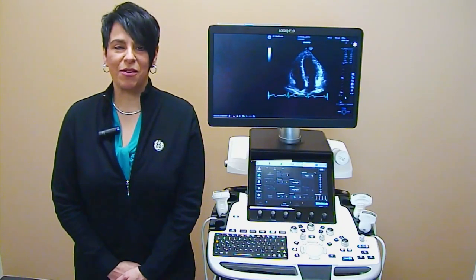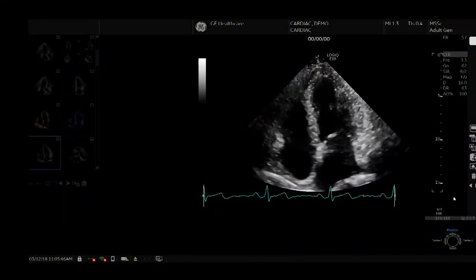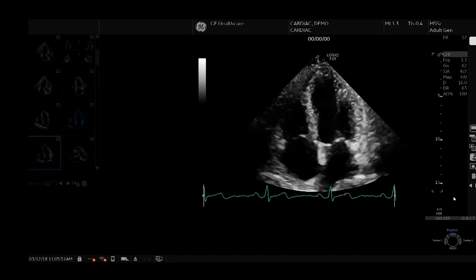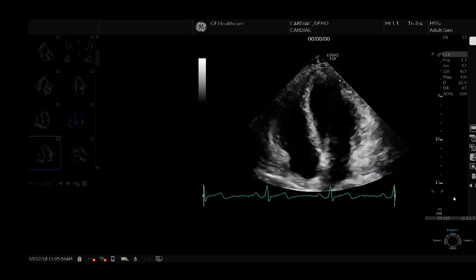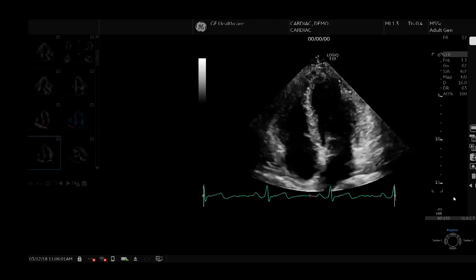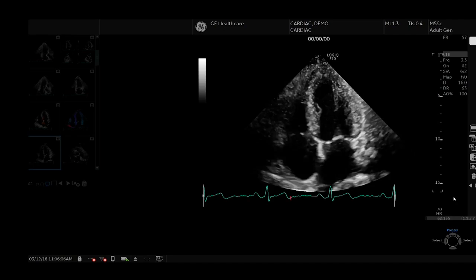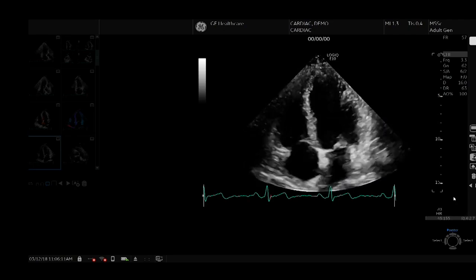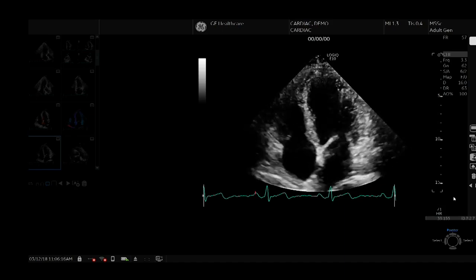Today I'm going to talk to you about our cardiac ultrasound on the new LOGIQ E10. Lengthy exams can be a challenge in workflow efficiency in cardiac ultrasound imaging. Central to the new LOGIQ E10 is the C-Sound architecture that combines versatile XD Clear probes and the new C-Sound image former to deliver exceptional image quality within fast scan times across a wide range of cardiac exams, even in challenging cases. The LOGIQ E10 with C-Sound image former cardiac application now features ACE technology in adult cardiac models.